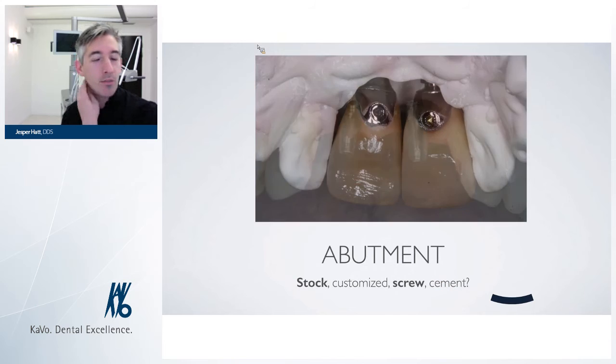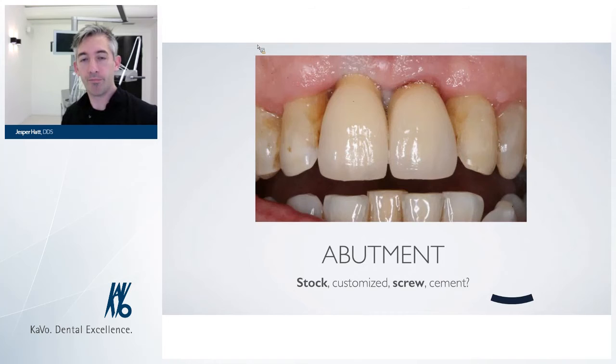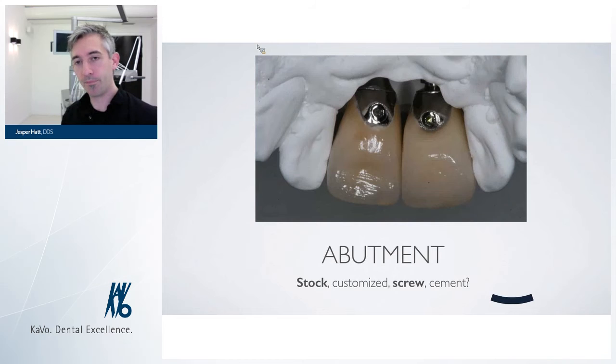And it works okay. We have these stock abutments, and we can screw in our crowns, and 3 months later it looks okay. Still not perfect, but okay. But if you take a look at tooth number 21, it's inflamed around the crown. I'm going a few pictures back here. You might recall, if you take a look at the abutment here, it's really not that nice. I really don't like the margin here.